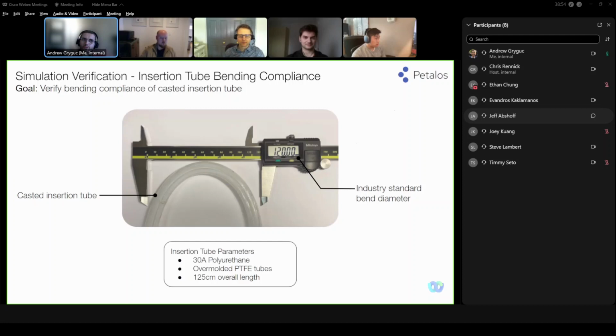One thing, and at the risk of sounding somewhat explicit, the feel of this device inside, I'm assuming there's some force from the spring back effect of actually bending the tube. Have you characterized that versus what the gold standard is right now in these types of devices? Sure. So getting those actual numbers for, let's say, how much force it takes to make this radius is pretty difficult, given that we don't have a $35,000 endoscope to play with.